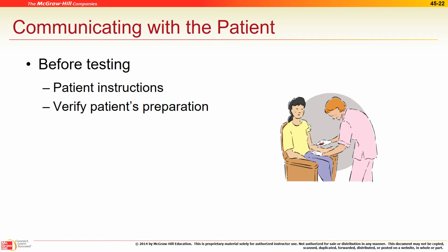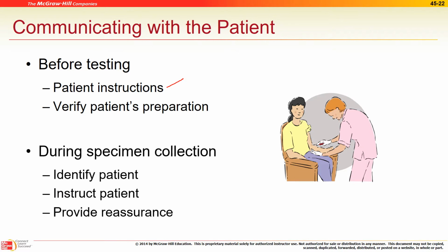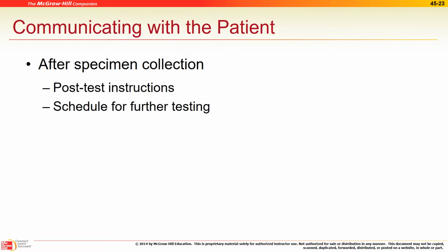All right, let's do some testing. Of course, instruct the patient, and then ID the patient as always. Collect the specimen. And then if you need to, you might have to fix it and send it out.